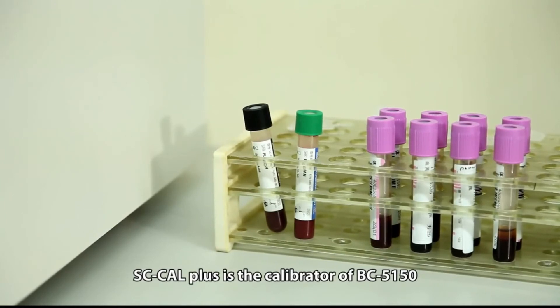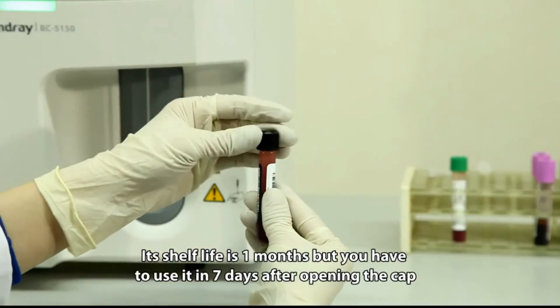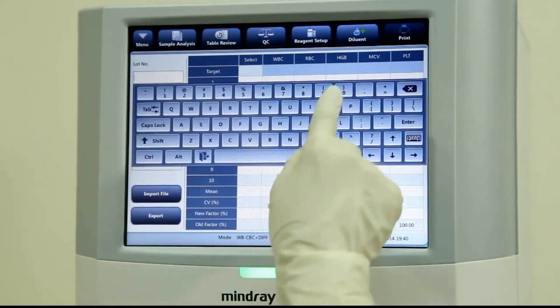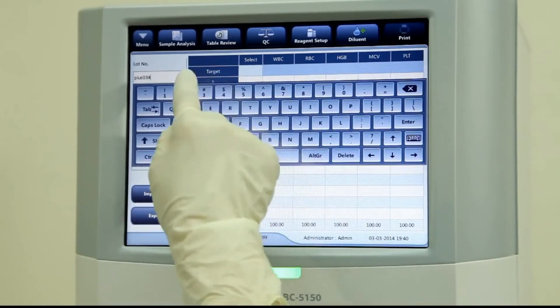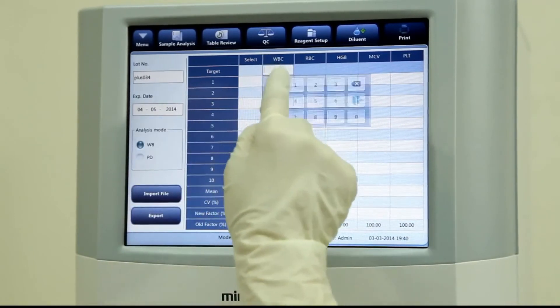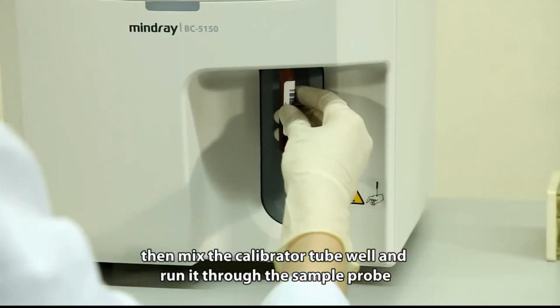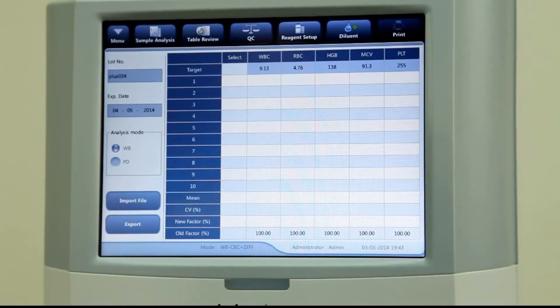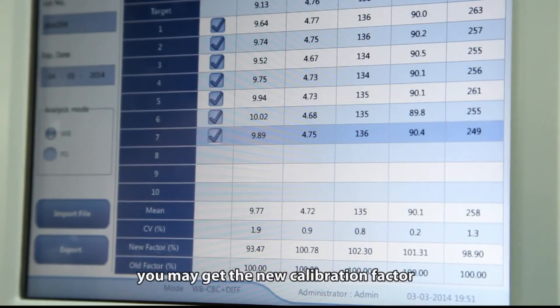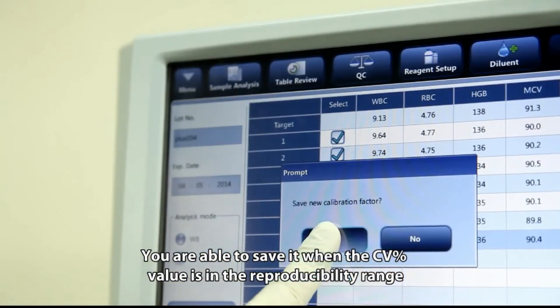SCCal Plus is the calibrator for BC5150. Its shelf life is one month, but it must be used within seven days after opening the cap. Calibration by calibrator is recommended. Input the target value of the calibrator first, then mix the calibrator tube well and run it through the sample probe. After running the calibrator six to ten times, you will get the new calibration factor, which can be saved when the CV% value is within the reproducibility range.